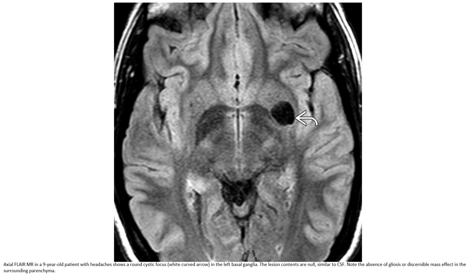T2 image in a nine-year-old patient shows around 60 cysts in the left basal ganglia. Note the absence of gliosis or surrounding white matter signal abnormality in the surrounding parenchyma, which favors a diagnosis of perivascular spaces.